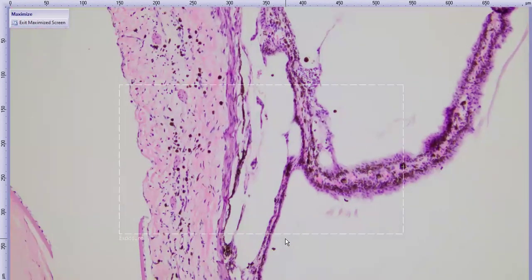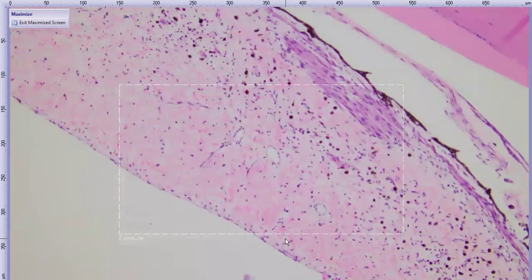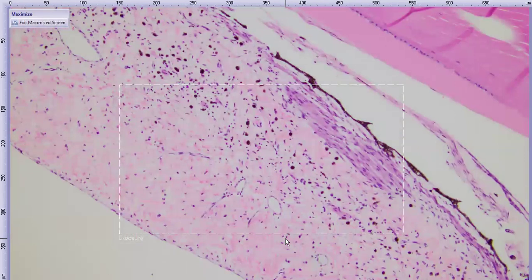So we said that lens-induced uveitis could present as a lymphoplasmacytic uveitis, and it can. But pretty much a lot of other things can present as lymphoplasmacytic uveitis. So reflex uveitis associated with corneal disease could present as lymphoplasmacytic. Any of a number of tick-borne diseases can present as lymphoplasmacytic uveitis. It's an extremely non-specific finding in the eye.